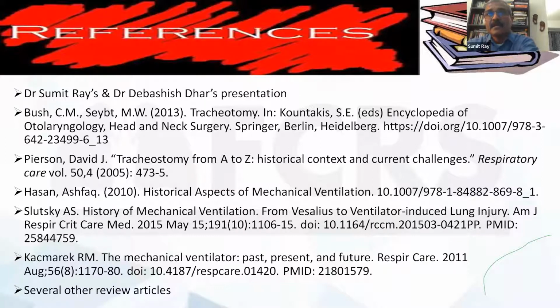Those are the most important lessons of history in general about medicine or science. Along with that, as you can see, there were different paths that could have been taken for developing positive pressure versus negative pressure ventilation. Negative pressure ventilation, as most of you know, is the more physiological ventilation, but because of the technological challenges in developing it, the patient comfort, and the size of the machines, the path which was relatively easier at that time, positive pressure ventilation, is the path that science took.